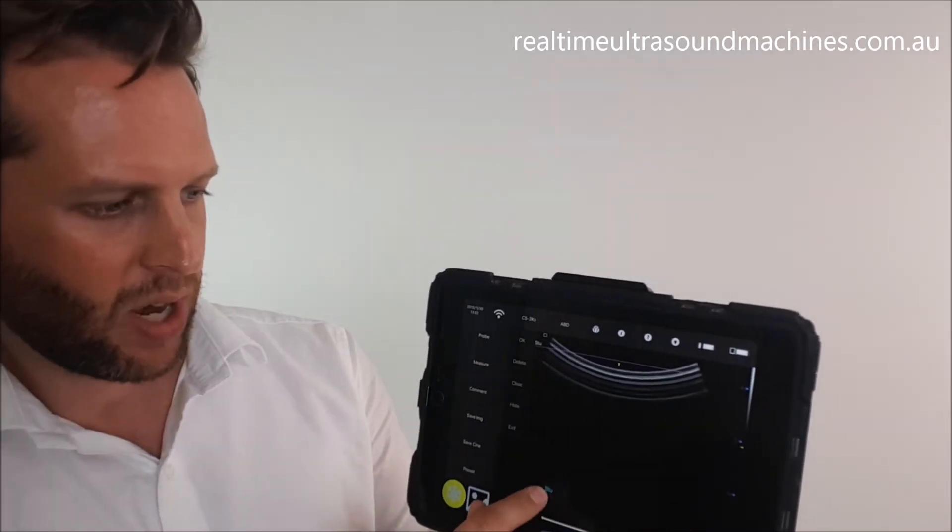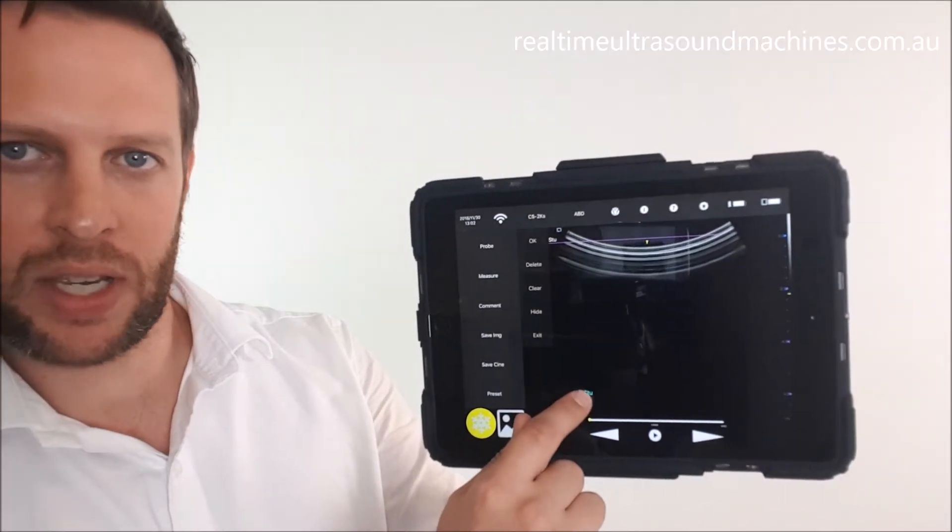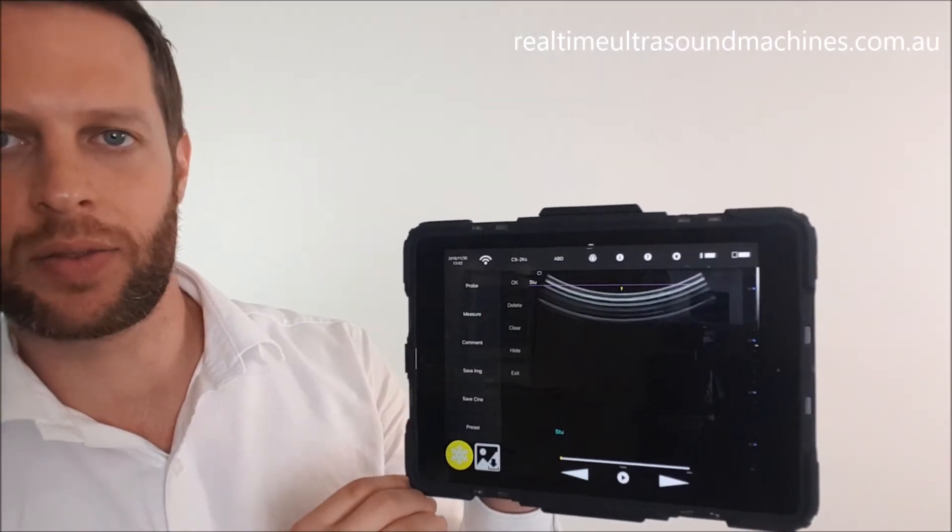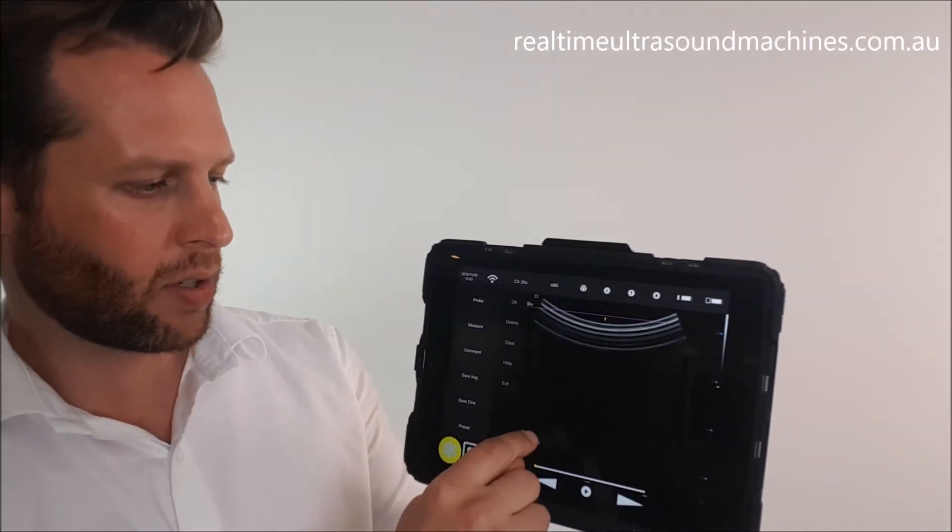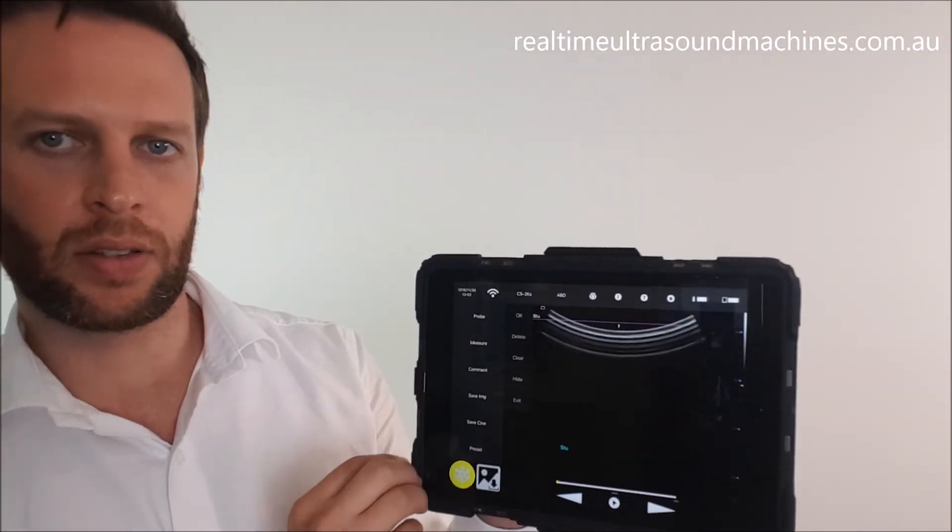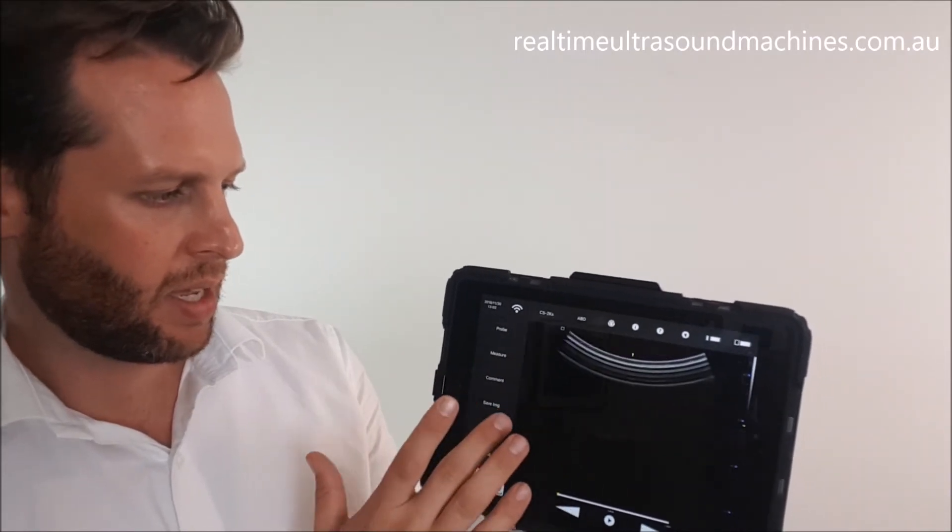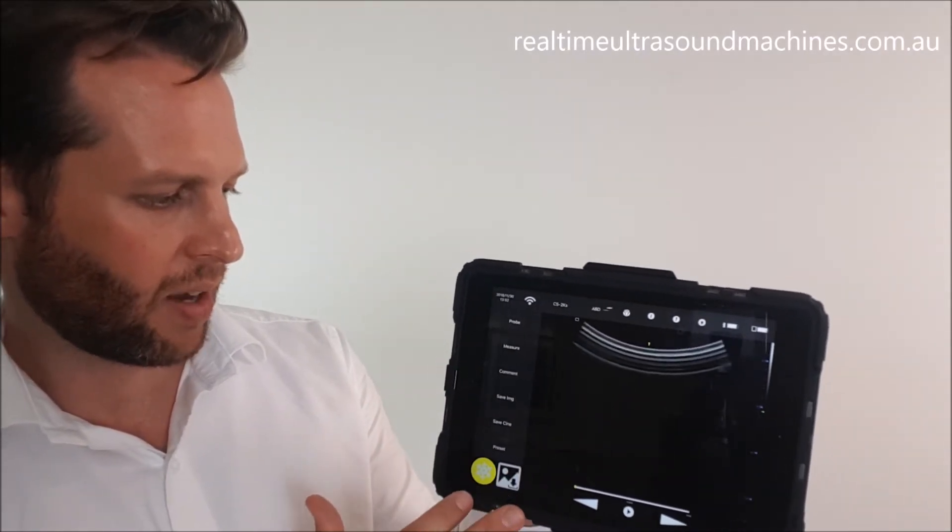We'll have the name here - we can drag that down to the bottom of the screen. I can hit save image and that image will save with my details on it, or of course you can make a comment about whatever you're looking at. To get out of this menu, you can hit clear, hit exit, and then unfreeze.